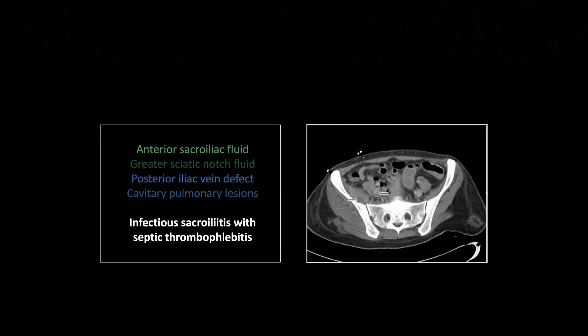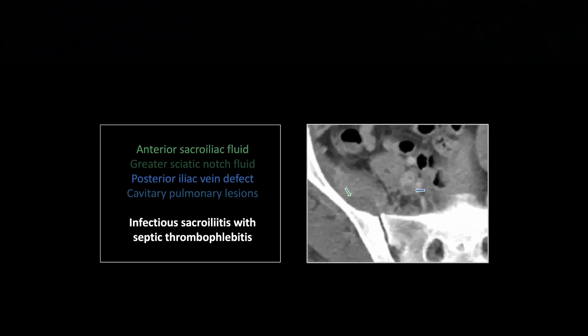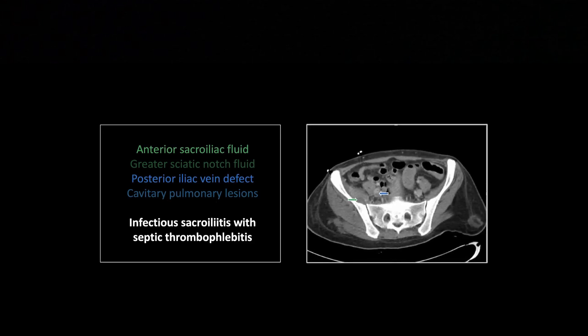The other finding here is a filling defect in the posterior iliac vein right at the bifurcation of the common iliac vein. There it is — you can just see that filling defect, that rounded thing in the posterior aspect of the common iliac vein, bifurcating right at that point.